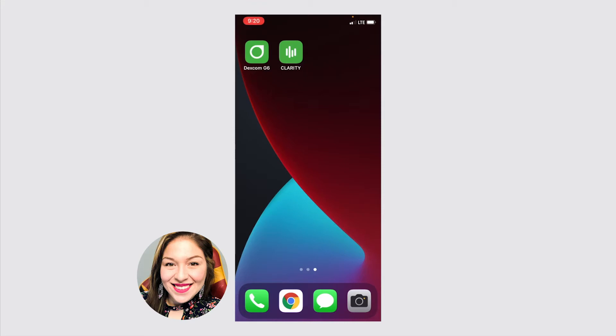Today we'll start with the mobile apps. There are two that you can use, and this is on an iPhone. For an Android phone it might look slightly different, but there is the Dexcom G6 app here on the left and then the Dexcom Clarity app on the right. We'll start with the Dexcom G6.